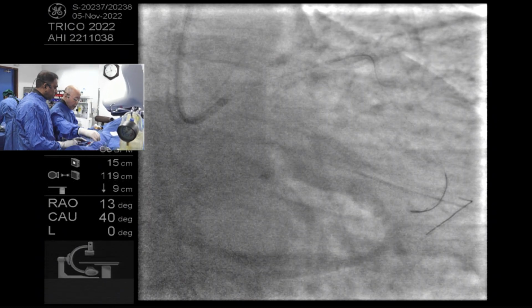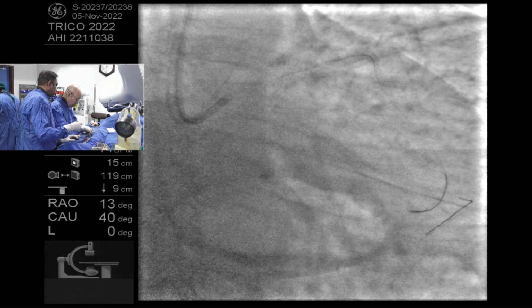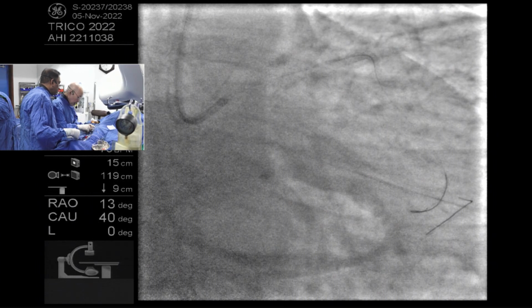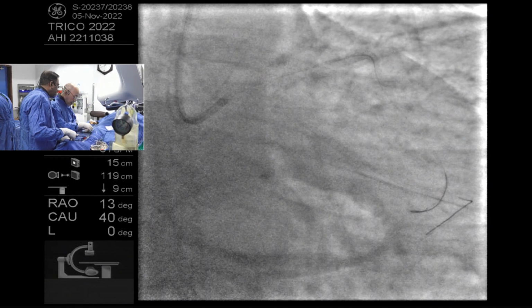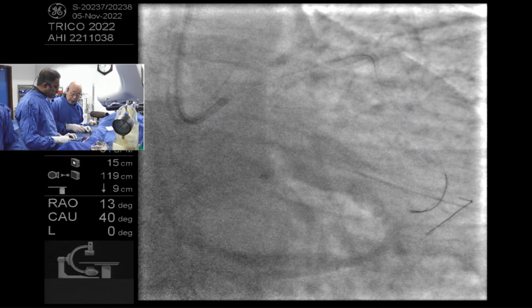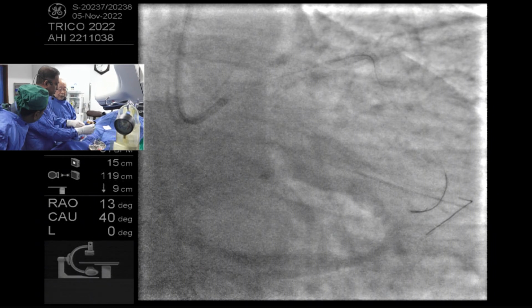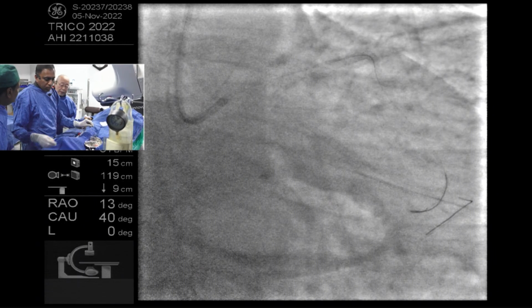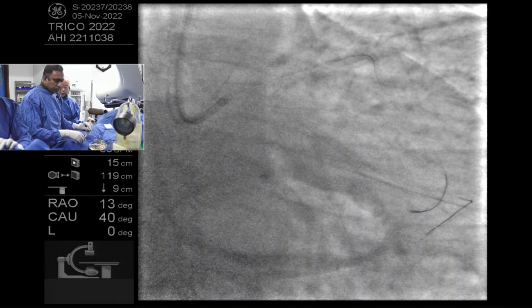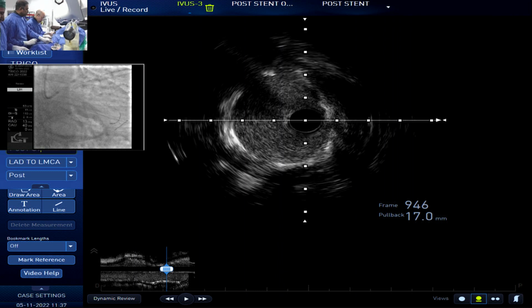Okay, so usually I do not do this kind of procedure, but on this occasion, because this is a live demonstration, I intentionally do IVUS. All right. Yes. Okay. To LAD. Yes. I think for the LEGEND technique, such frequent IVUS is not necessary, right? But yeah, this is a live demonstration. He kindly tried to do the IVUS.